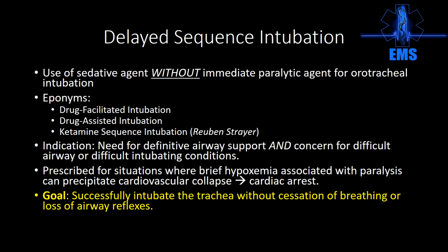Don't try to pass the tube on a spontaneously breathing patient. It doesn't really work out that well. We did that for years with nasopharyngeal or nasotracheal intubation, and you can end up actually rupturing somebody's cords. That's a bad day. If you really had to, I suppose it would be acceptable. But ideally, if you've got a great look at the cords, have somebody push some rock or some sux, and then take the airway. So this is also called drug-facilitated intubation or drug-assisted intubation.